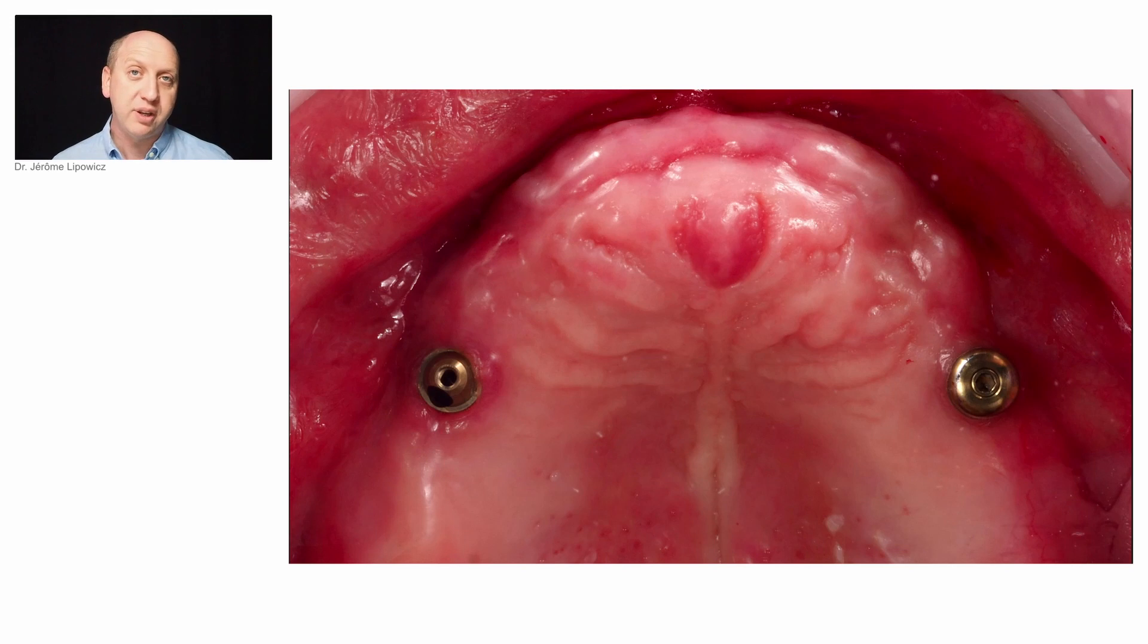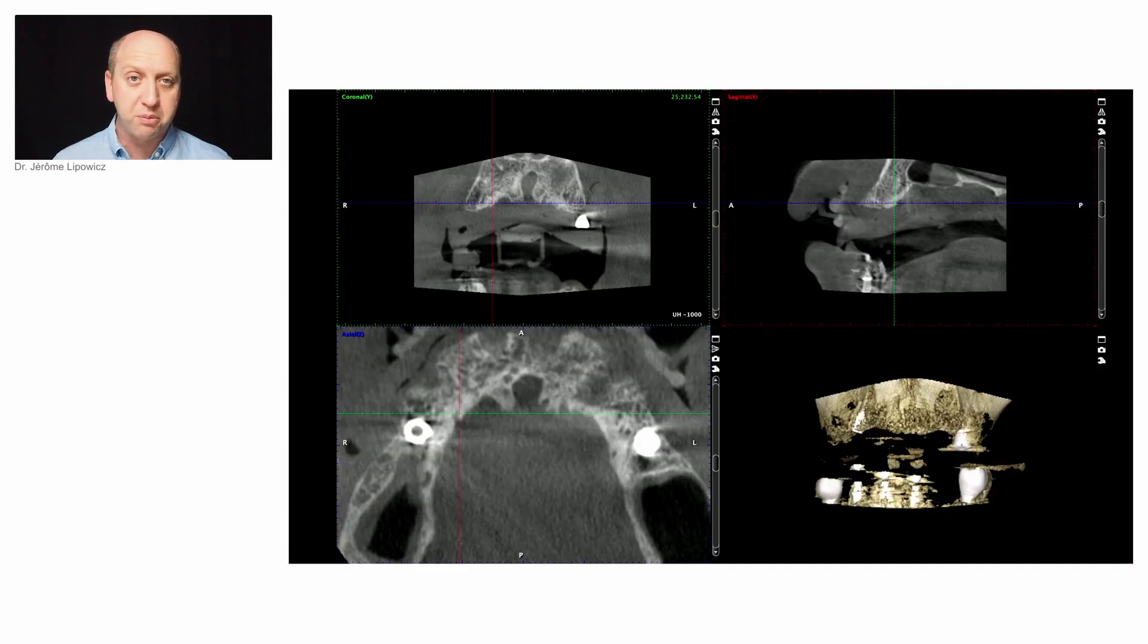One recurrent issue in clinical cases where the purpose is to make a full arch bridge on implants is either the presence of metal on all the residual teeth to be extracted or, on the contrary, the lack of fiduciary marker. In these two situations, reading cone beam CT can be very hard.